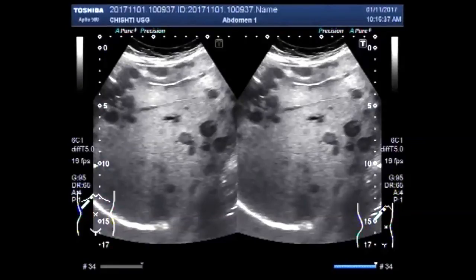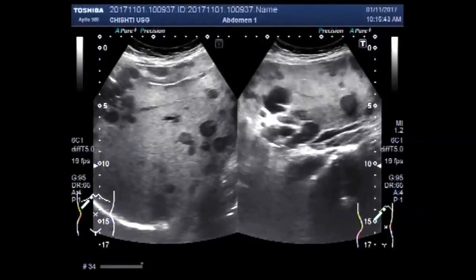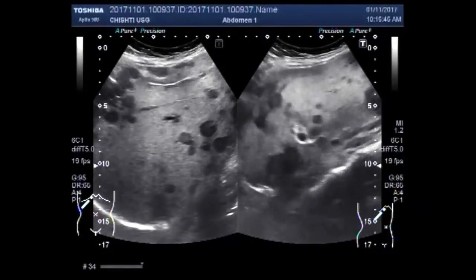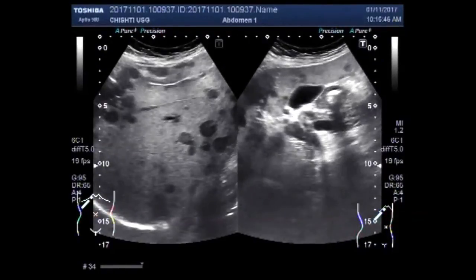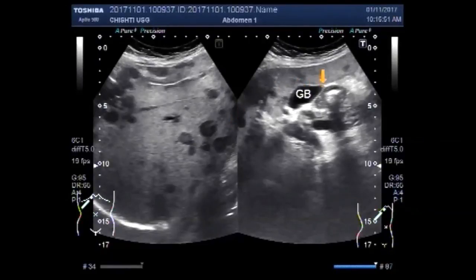Now we put the patient on their side. You can see the gallbladder and liver.